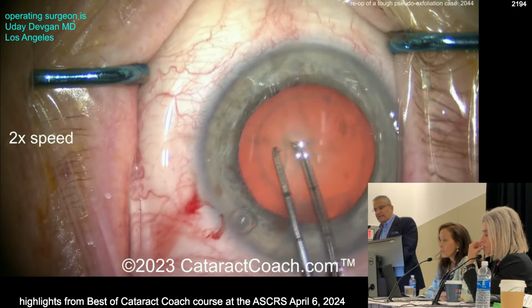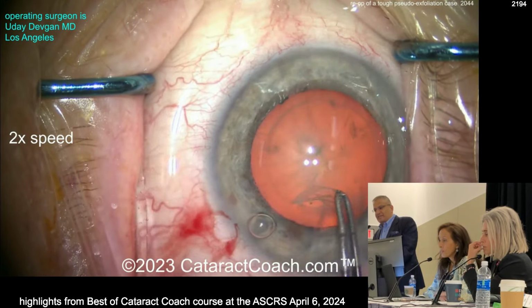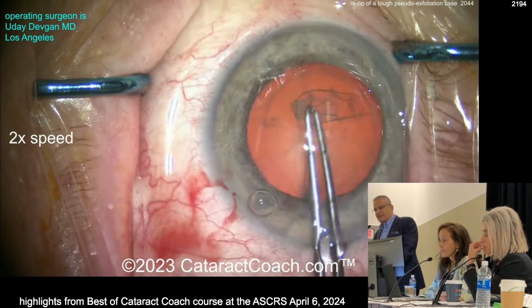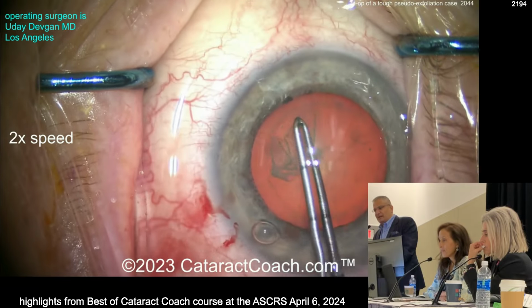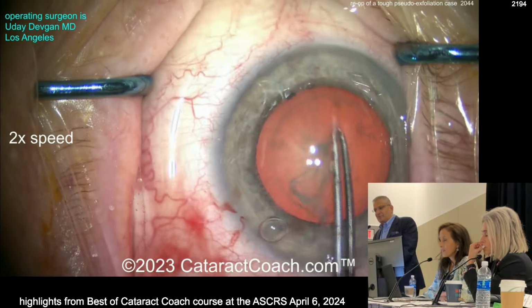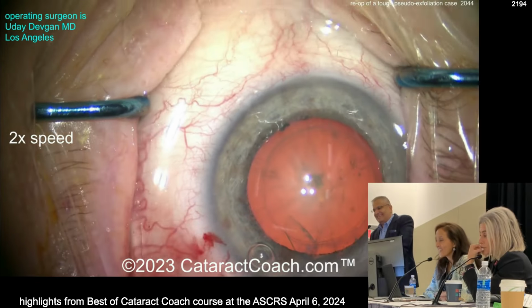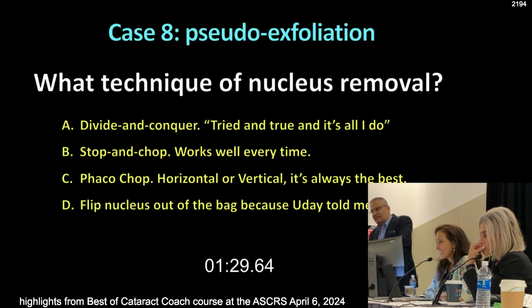You can see there's a little wrinkling there in the capsular bag. So we'll get a nice generous rhexis here. I've learned from you, DP, don't make a baby rhexis in a pseudo X case because they're going to get phimosis later. So we'll get a nice generous 5 millimeter rhexis, nicely using that pseudo X as the guide. Yeah, that was convenient. Right, and then we'll get this nucleus removed pretty easily. Definitely going to put a CTR here too.